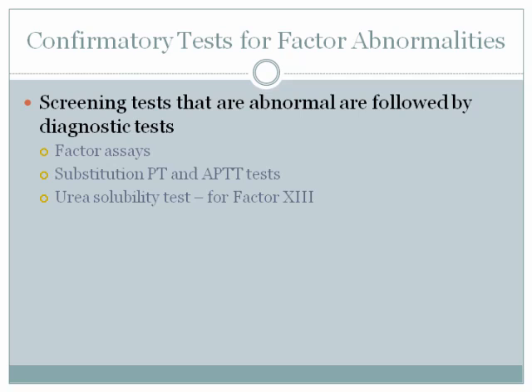We also have what we call substitution or mixing tests. We are going to talk about that more in detail here in just a second. And then we have the urea solubility test. Again, that's only for factor 13. So if the physician has some idea that, you know what, I really wonder if their factor 13 is out of whack, they can do that test.